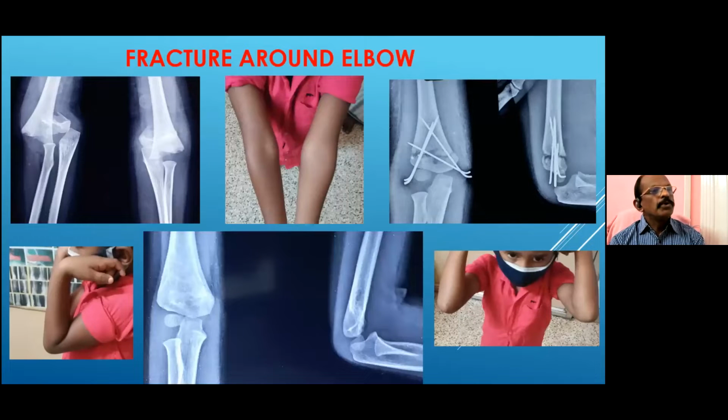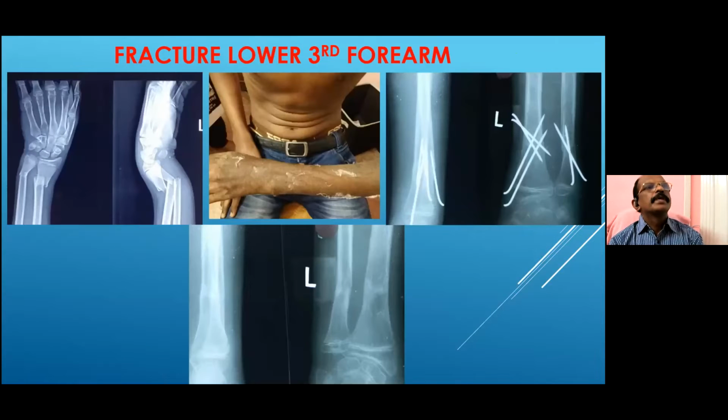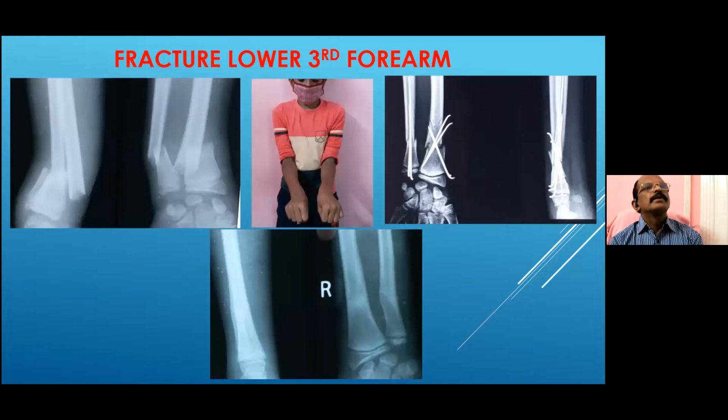This is a fracture around the elbow, the type 3, and this is also done with closed reduction and percutaneous pinning. This is a fracture of the lower third forearm, fracture both bones. I have done this closed reduction and percutaneous pinning for this fracture. This is another type. Here, closed reduction and percutaneous pinning for the radius and also for the ulna, as it is a small bone. In another method we can introduce intramedullary fixation from the distal ends.